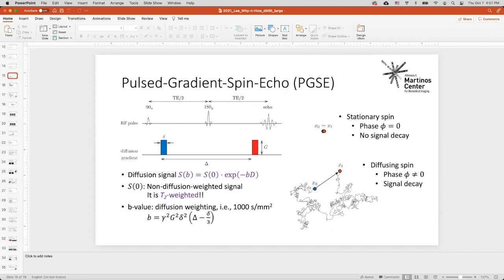So yeah, indeed, for diffusion measurements in gray matter, the problem is the resolution, because the cortex is very thin. And the second problem is SNR, because when we have high resolution image, voxel size is small, so SNR is low. Or for example, if we focus on deep gray matter, the SNR is usually low at the brain center.